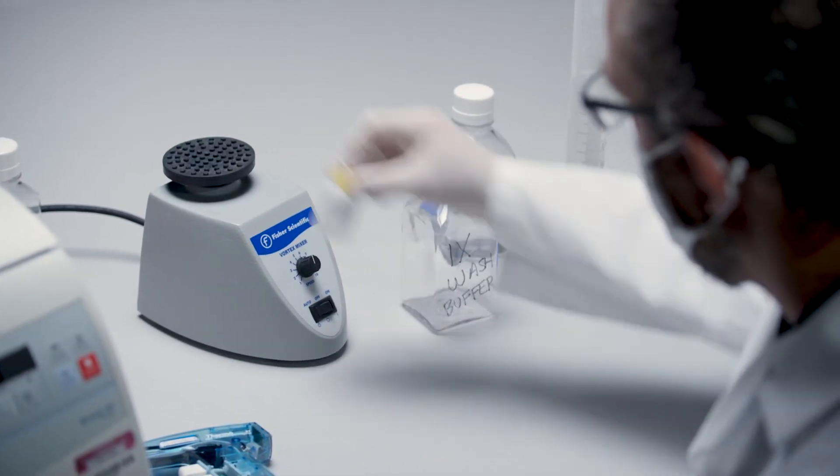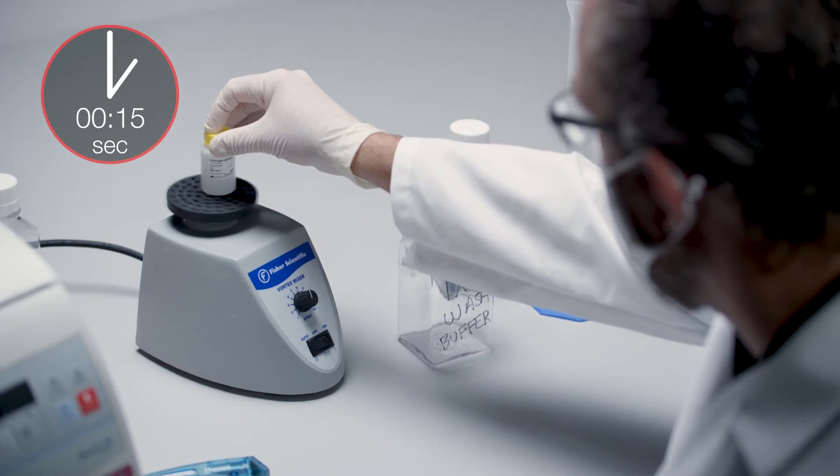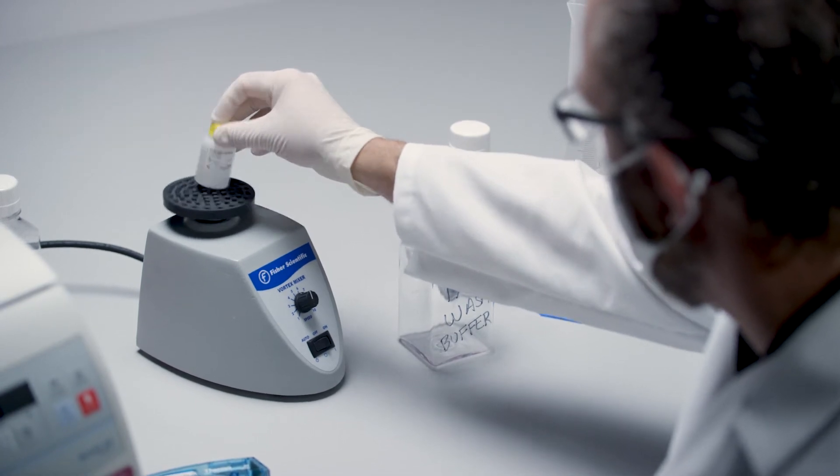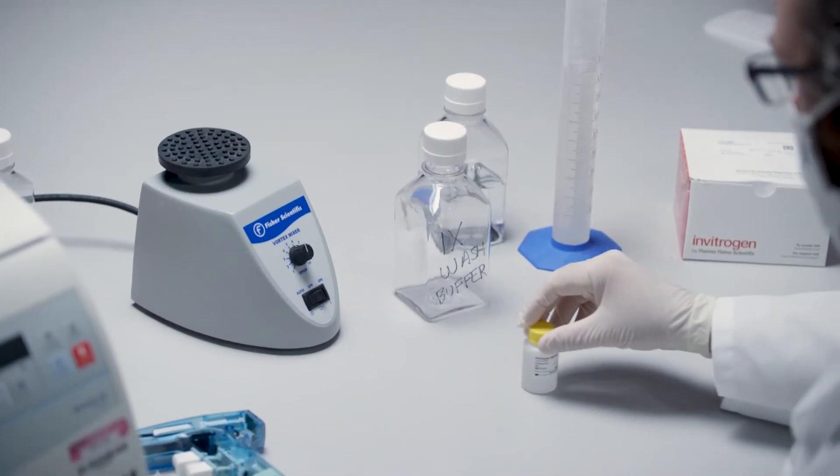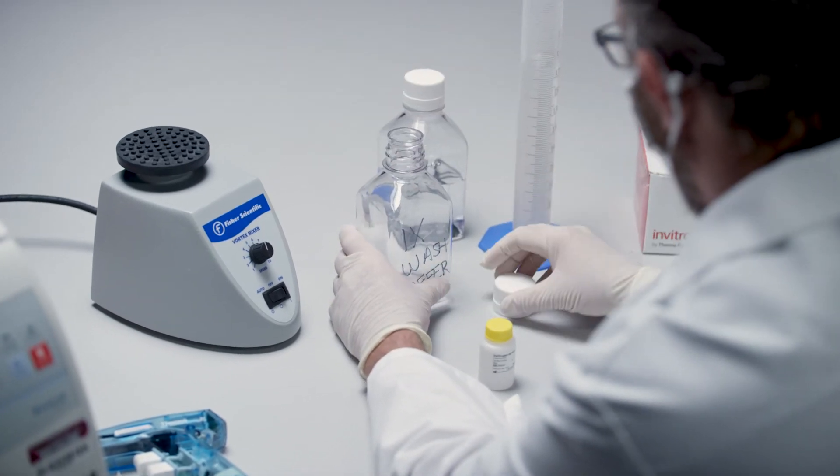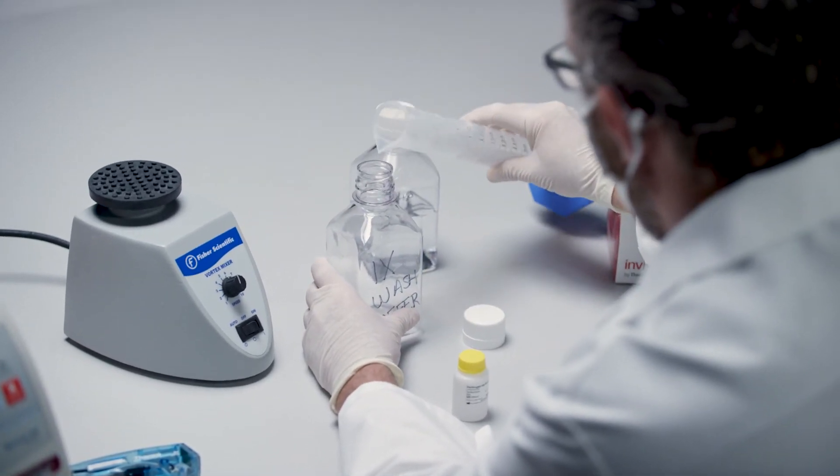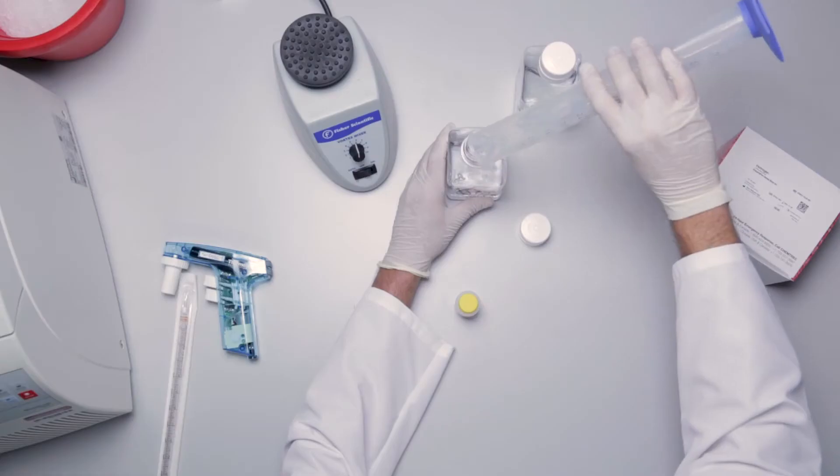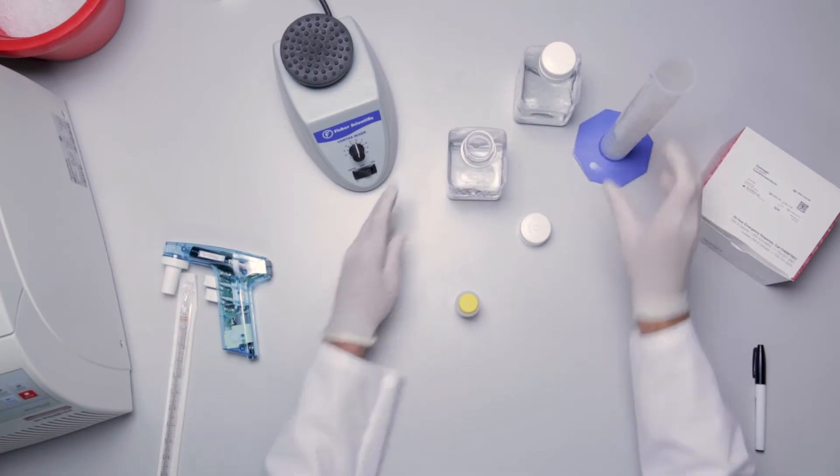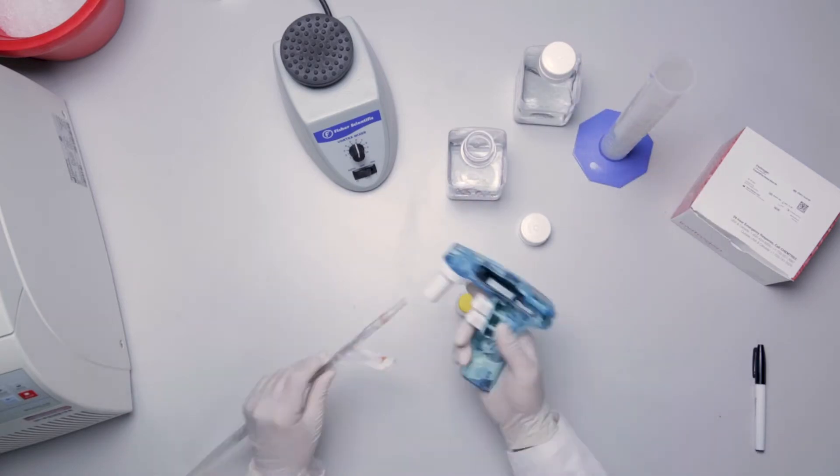Gently vortex the wash buffer concentrate for 15 seconds. Mix 20 milliliters of wash buffer concentrate with 180 milliliters of deionized water using a 200 milliliter graduated cylinder.